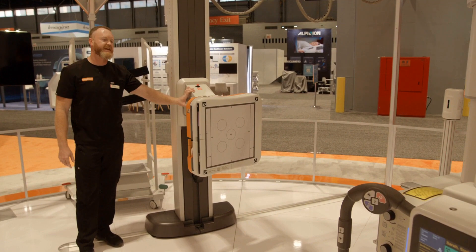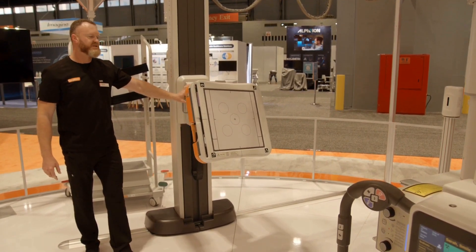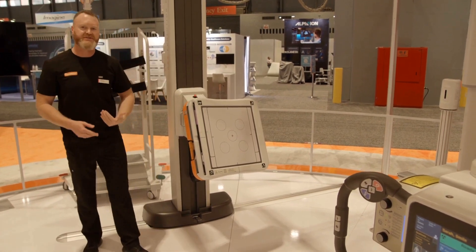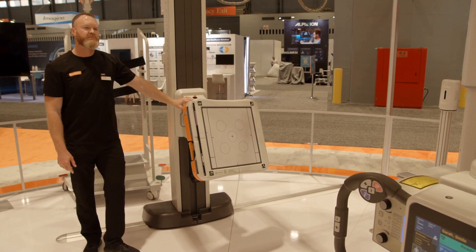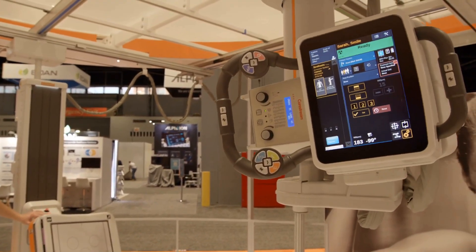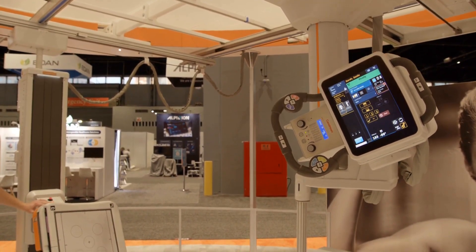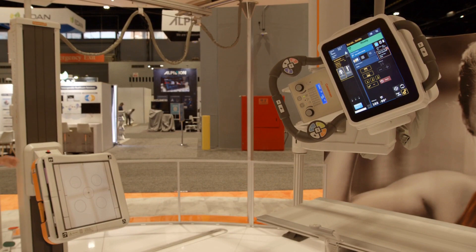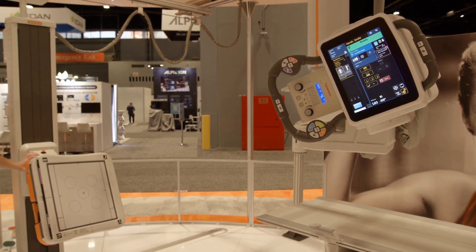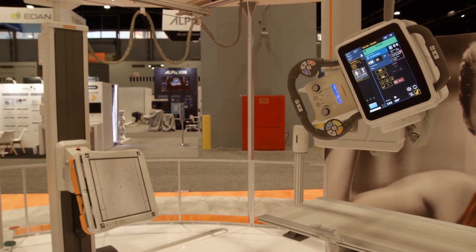I'm going to angle my wall stand up a little bit. These complex angles I can put on this wall stand to match a patient's position, and then use my auto-centering feature to tell the tube to line up to the wall stand. Once it's in position, you can track this by simply telling the wall stand to track or the tube to track as well.